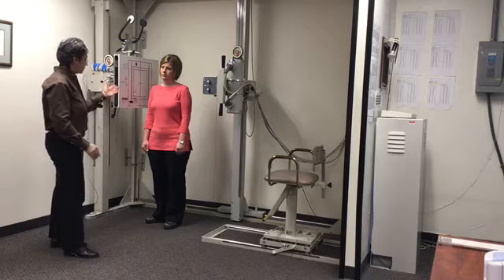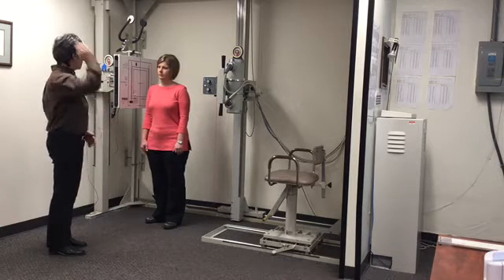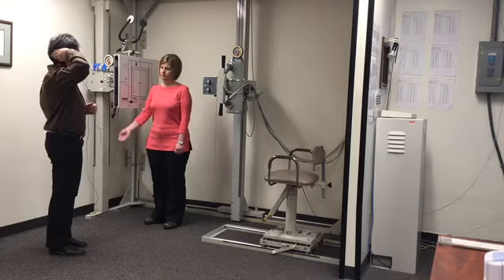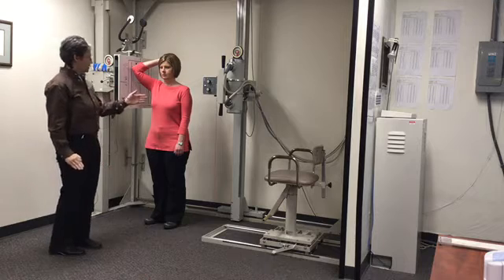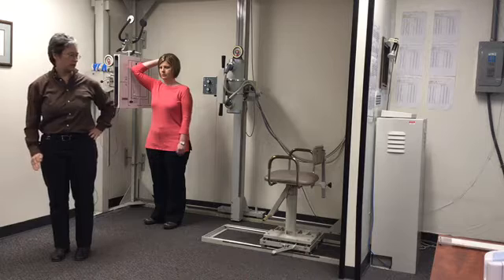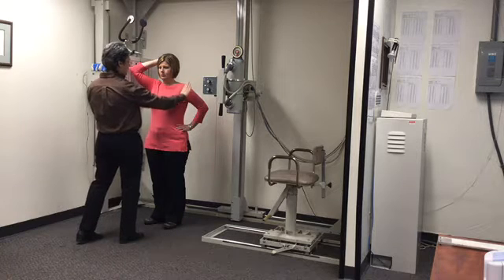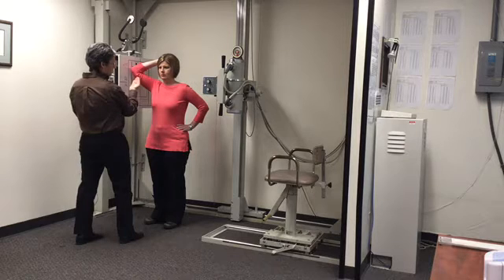So before I do this with you, I want to ask you, do you have any problems with your shoulder, elbow, wrist? Can you go into this position comfortably? I can. Okay, so the hand that is closest to the board, I'd like you to go ahead and cup the fingers and bring the palm up at your occiput. Okay. The hand that's closest to the tube, the patient is going to hold in the back of her hip around the SI joint, okay? And what that does is that positions the humeral head that's closest to the tube posterior to her spine, and the humeral head that's closest to the bucky anterior to her spine.